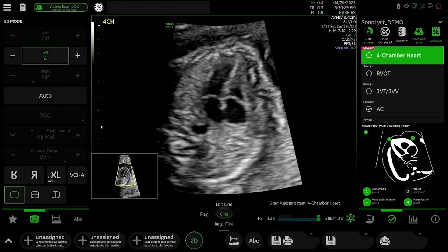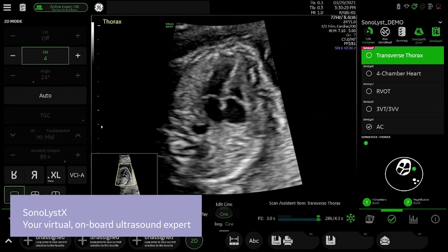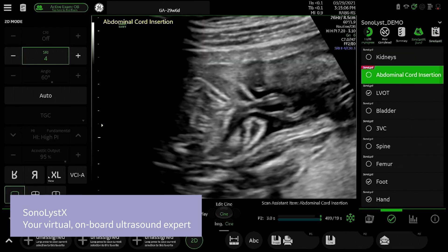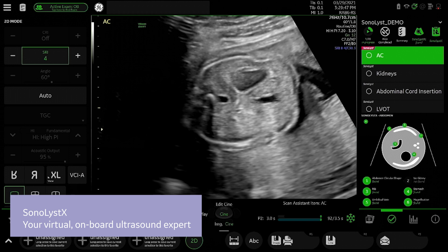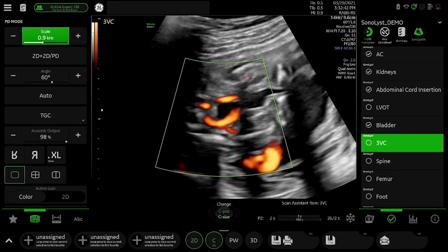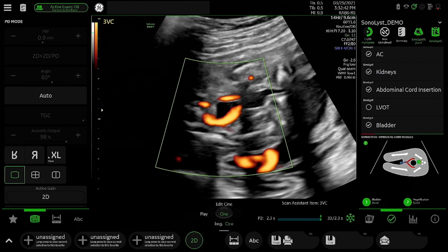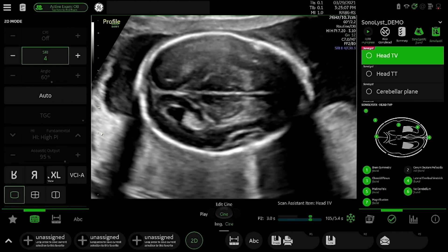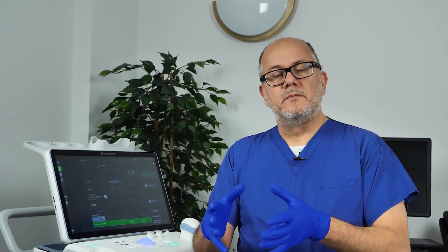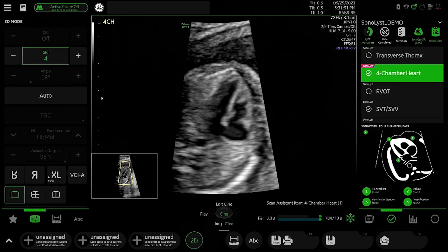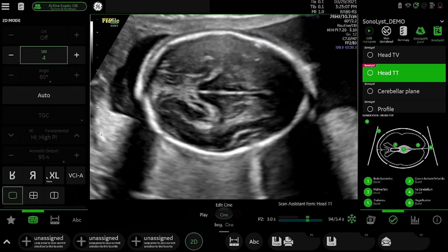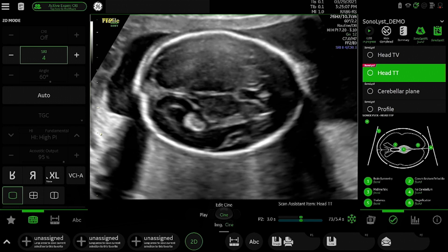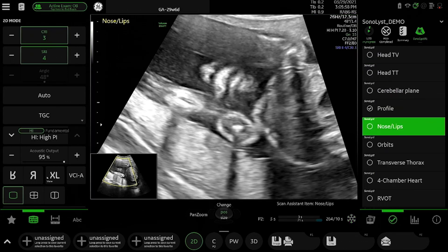The second thing is that it recognizes the quality of the images by assessing standard image-based criteria. So in the abdomen, for example, it will check that the stomach is visible, that the umbilical vein is a third of the way along inside the abdomen, that you have a nice circular abdomen, and so on. So not only is it looking at the completeness of the record, but it's also making sure that the images you're acquiring are fit for purpose — for your imaging record, but also for the reporting radiologist.